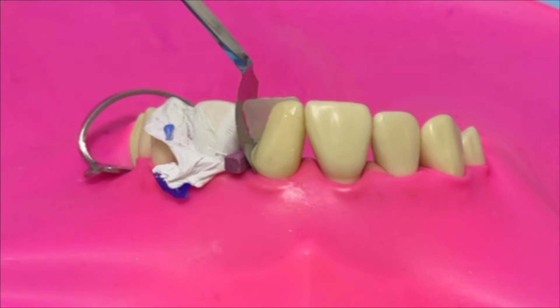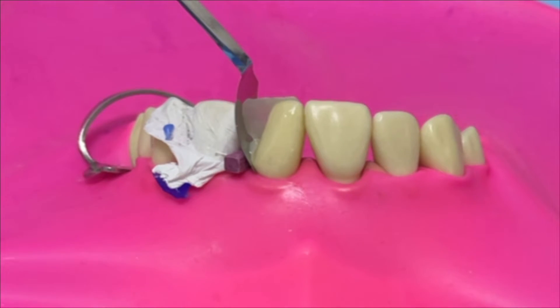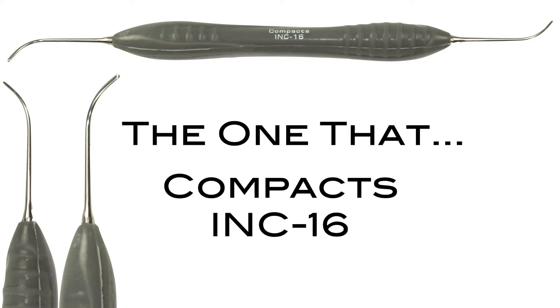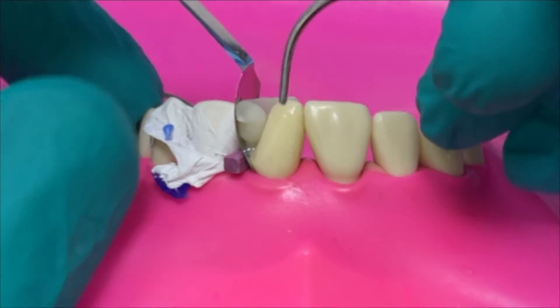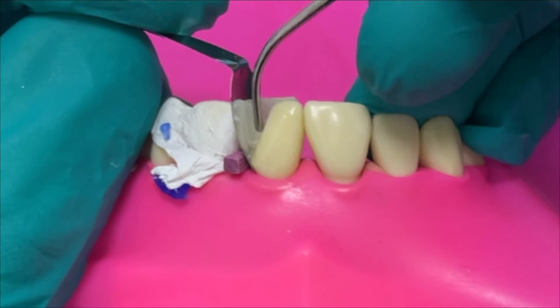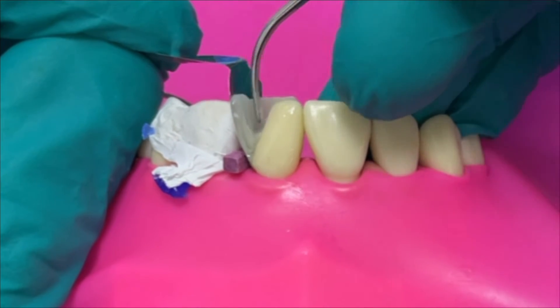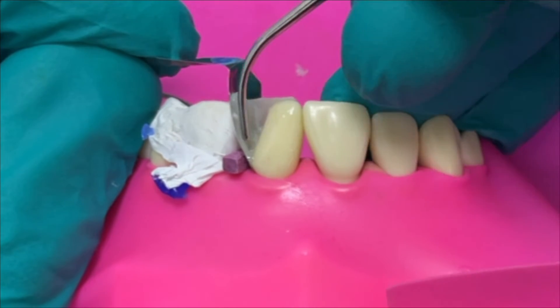Now we're going to build the proximal wall using composite. I like to put a little drop of flowable in first, as close a shade as I can get to the restoration - it's just a wetting product that's going to stop air inclusion. Then I'm going to place my composite ready for the proximal wall. To adapt this we're going to use the one that compacts. This is a classic instrument and one I use the most - it's got two pluggers, lovely and round, perfect for composite, in two different sizes so it's very versatile. I'm using the small end here, holding the matrix band slightly away with the handle just to make sure I get far enough distal and get the correct curve for this particular tooth.